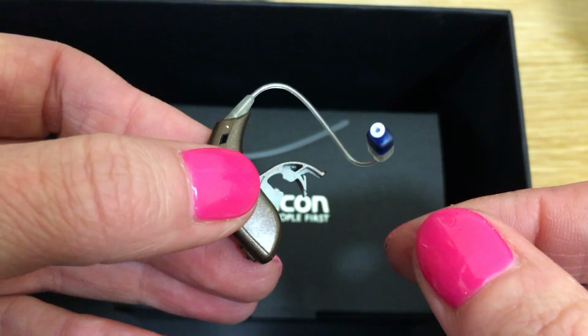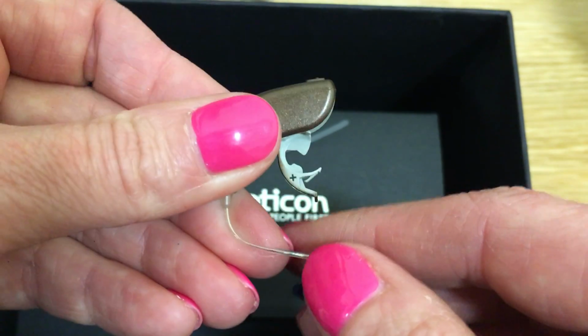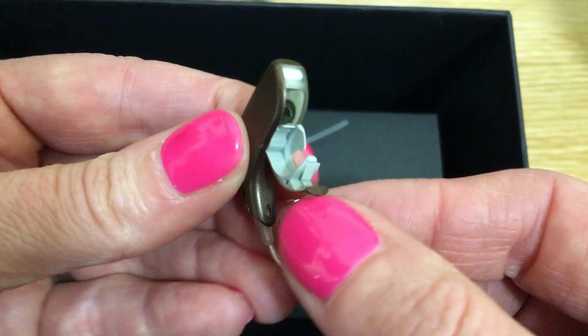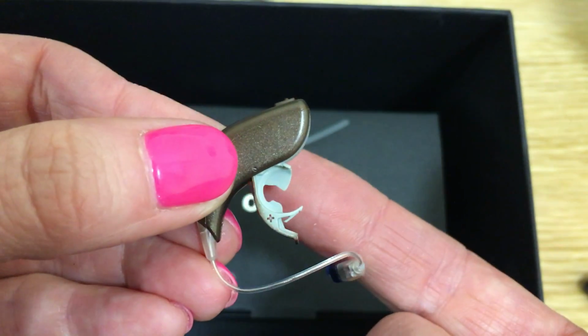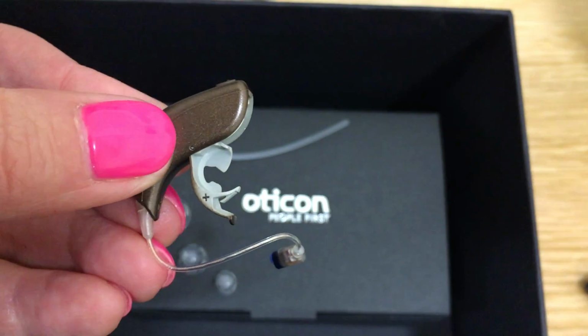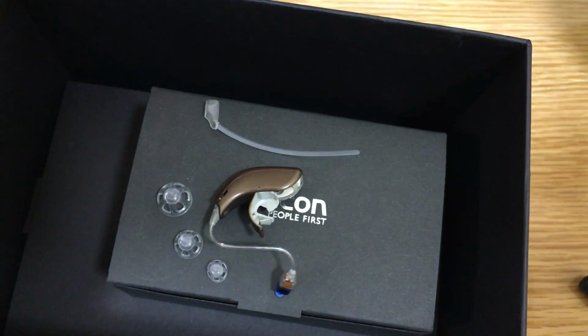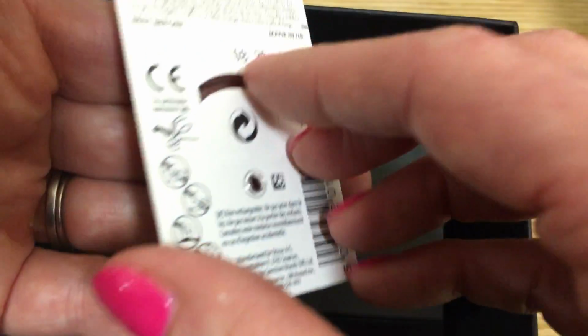We will now insert a battery. The battery drawer holds the size 312 battery, and as we can see, this bottom side of the battery has a little shelf to hold the battery in. We use the size 312 battery.